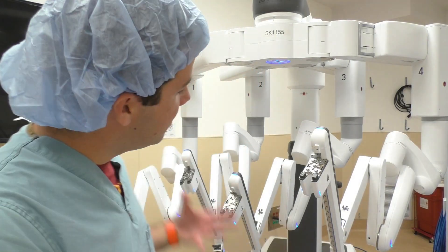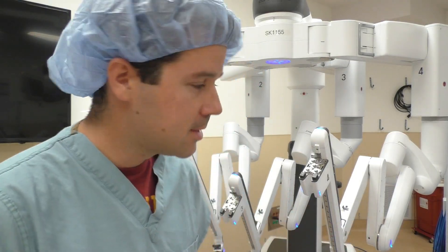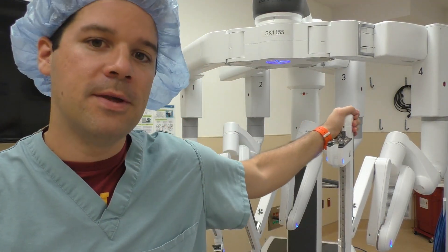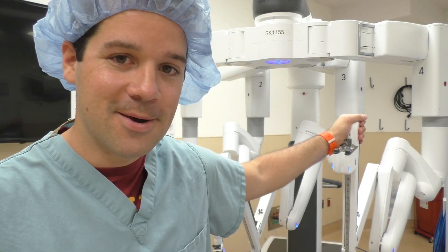Hey guys, welcome back to another Surgical Tech Tips. We are still here with the robot, and today we're going to be talking about draping the robotic arms — everything about these arms: how to control them, how to dock them. Let's get going.